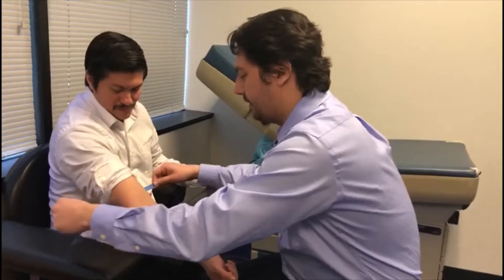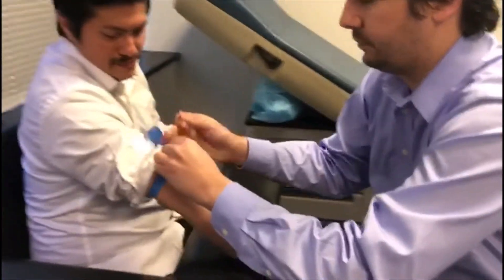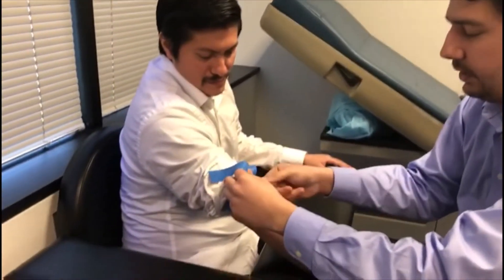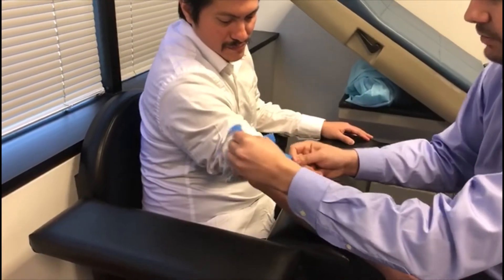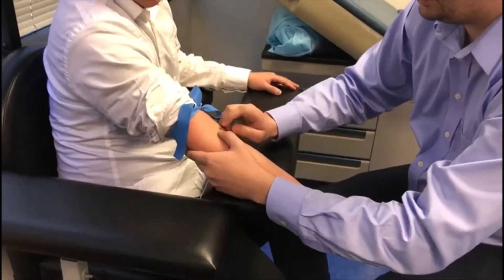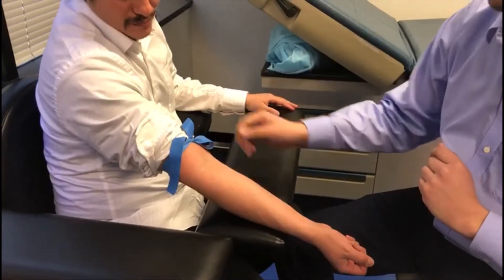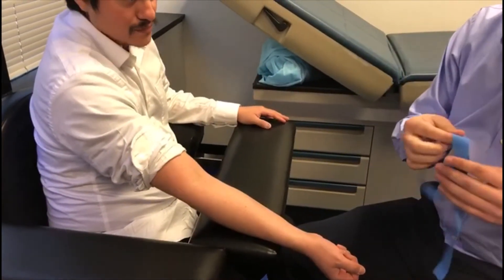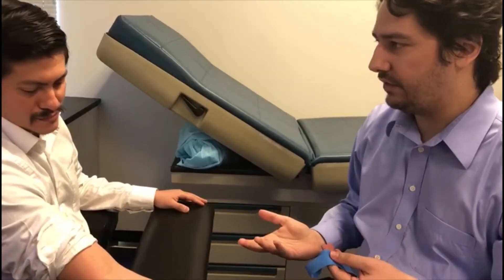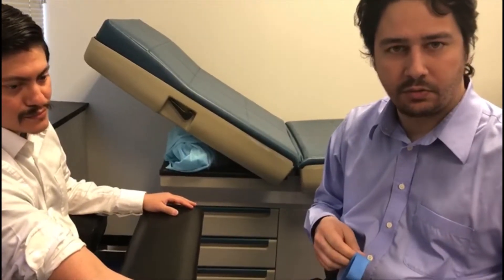We're going to apply the tourniquet nice and tight, and we're going to put a little loop — we are not putting it all the way through. If you notice, there's that nice loop, and I can actually make it tighter. We're going to locate the vein — it's going to be right there. You can easily feel it, easily palpate it. The reason we do that loop is so we can easily remove it. The tourniquet should not be left on for longer than a minute for two reasons: one, it can cause nerve damage; two, it could cause hemoconcentration, which would cause erroneous results.